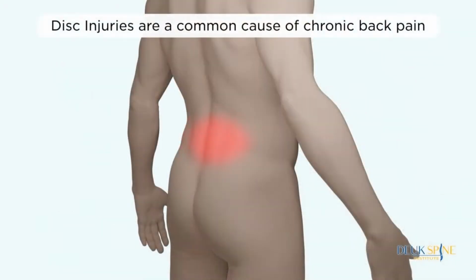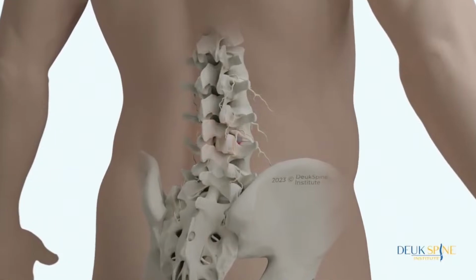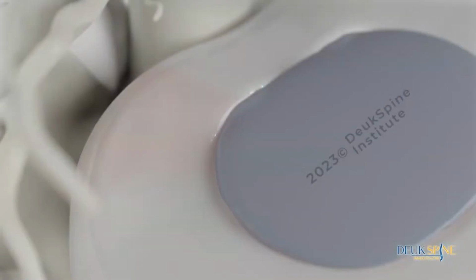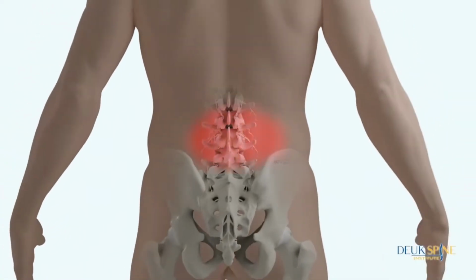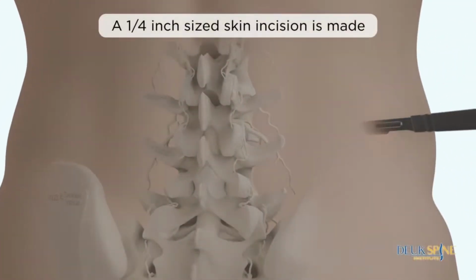Disc injuries are a common cause of chronic back pain. The inflamed annular tear causes back pain. A quarter-inch sized skin incision is made.